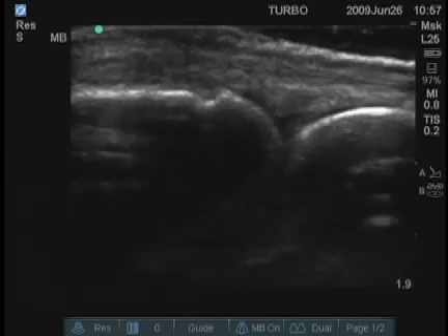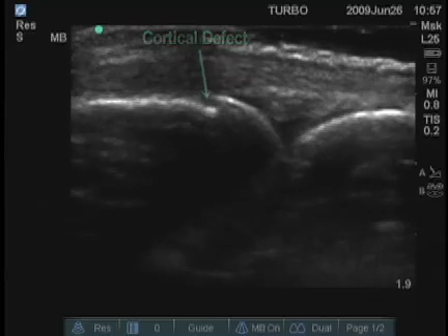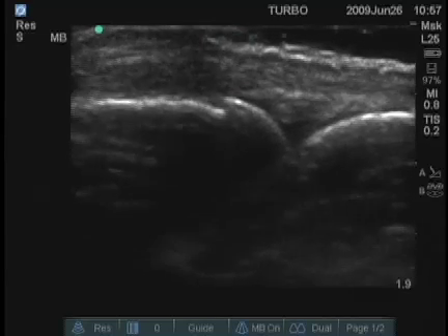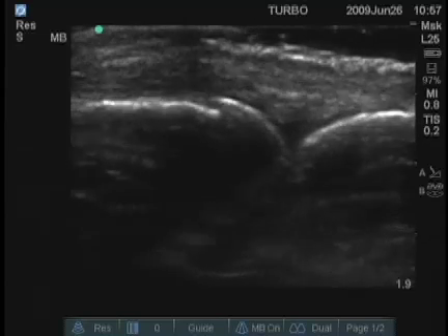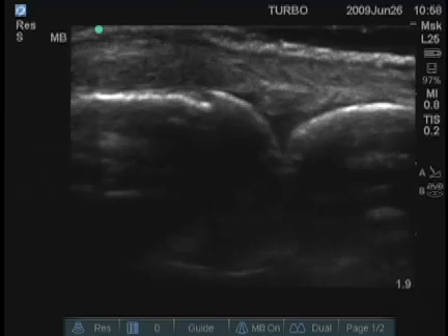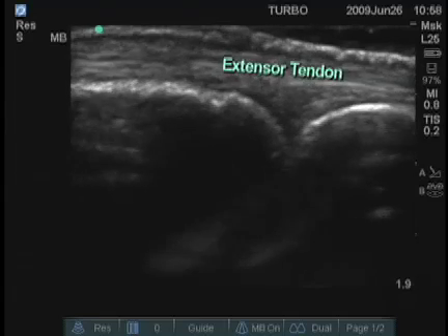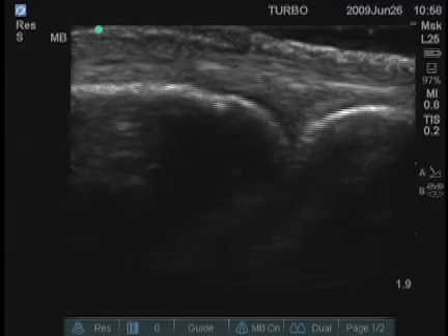There's frequently a small articular cortical defect on the dorsal surface of this metacarpal — that is not an erosion. An erosion would appear elsewhere with this type of appearance. We can also see the extensor tendon superficially right under the surface of the skin.